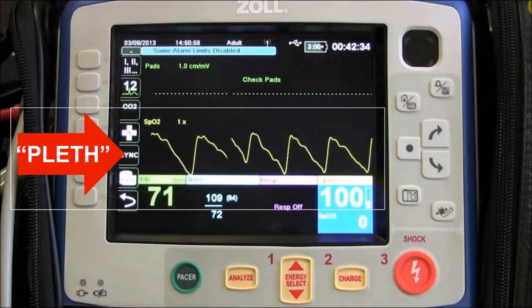This is pleth — that pretty little line that's usually right in the center of the CO2 and the lead two display on your average monitor, be it LifePak, old Phillips, what have you. It's a line we don't always pay a lot of attention to. We've always been told pulse oximetry was unreliable and it would lie to you, and those statements are not necessarily wrong.